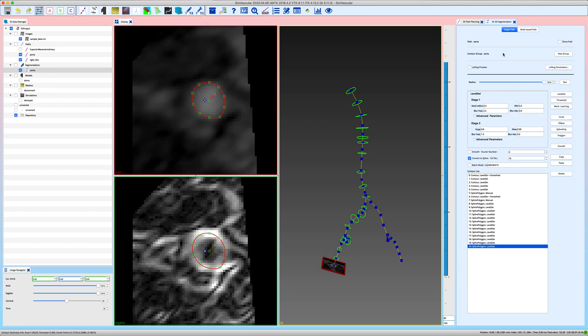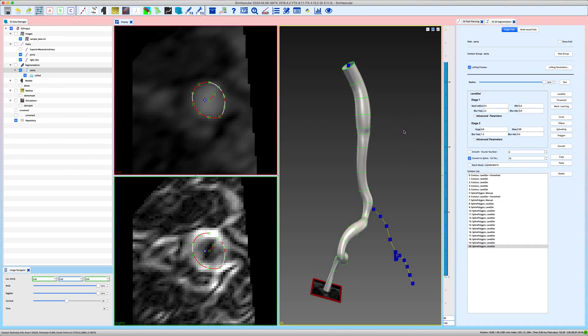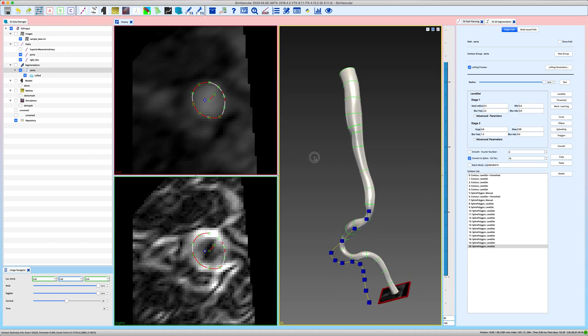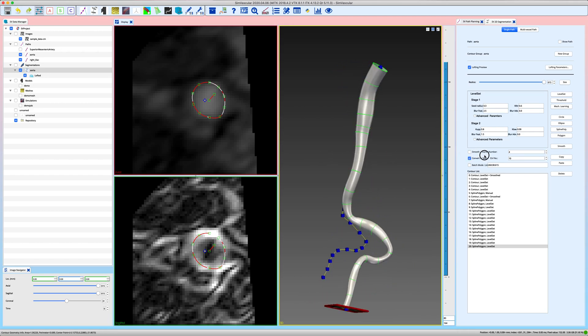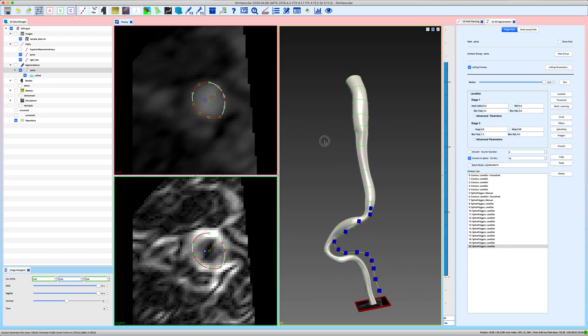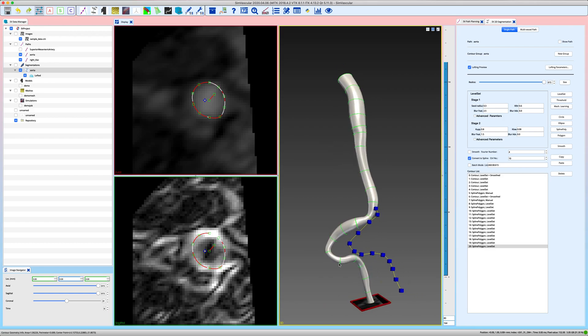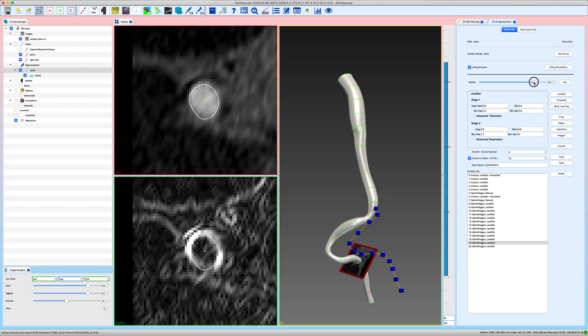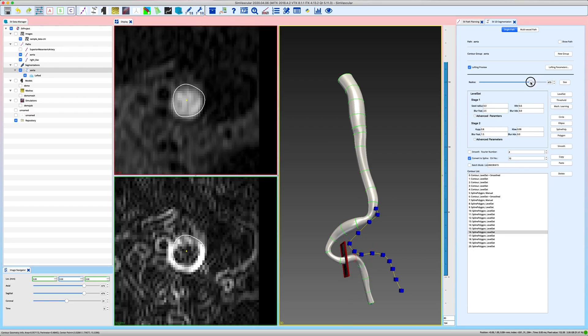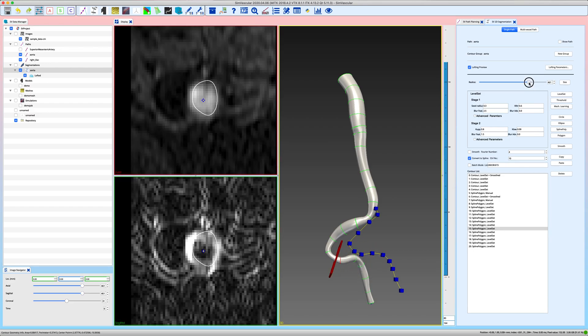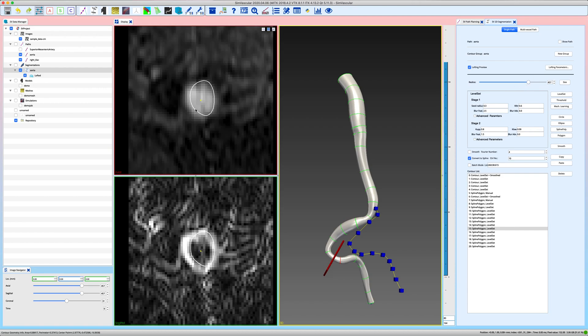And another feature that allows you to judge whether your segmentations are doing okay is this lofting preview window. If you toggle it on you will see the lofting of your final vessel. And you can maybe already see that in this area you might be off a little bit. To better see how far off you are, you can again use your reslice plane and just move along the vessel path. And here we can actually see how our segmentation, the lofted segmentation and the actual vessel differ.